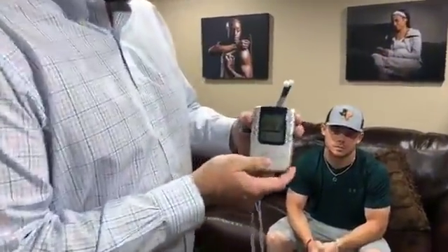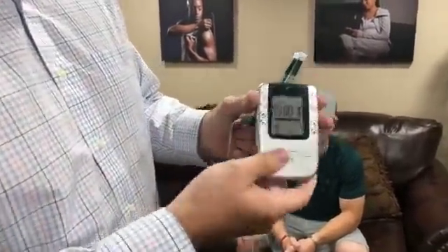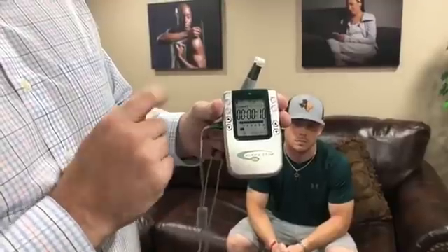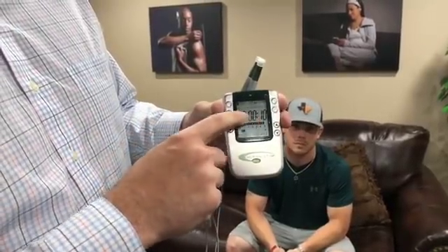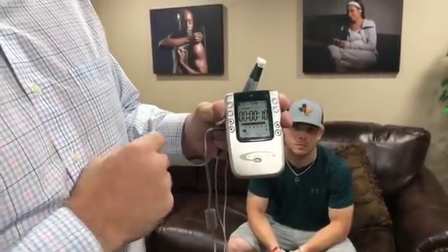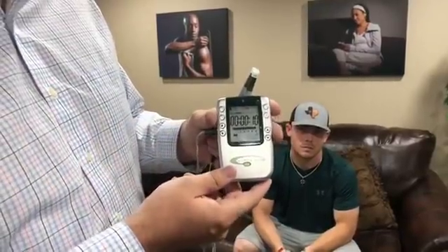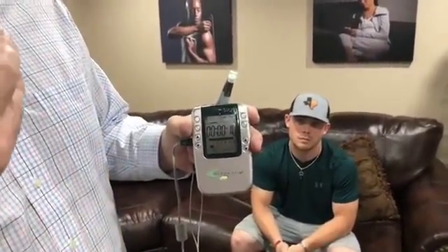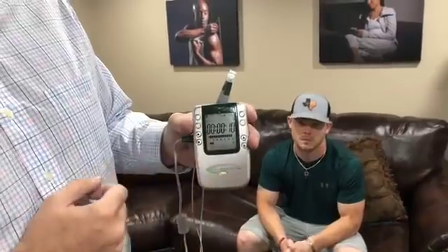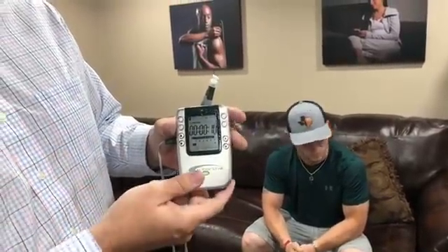The first thing we want to do is make sure you have your device set up. We have our device set up to treat with the smart probes — the probes and the electrodes are plugged in. A couple things about the device: we want to make sure we're on 0.5 Hertz, that's our frequency, we always use that for the probes. We're on our 10-second timer set up to the far left. We'll hear a beep every time we touch the skin to start the timer, and another beep at the end of 10 seconds. Our intensity is going to be all the way up to six on the dial. For Travis, since we're treating the extremities and lower back, level six should be fine — he'll feel very little.